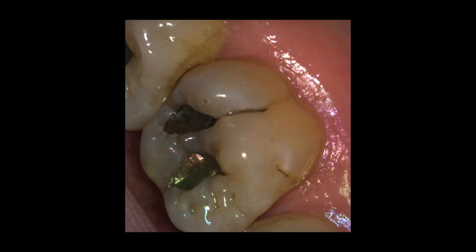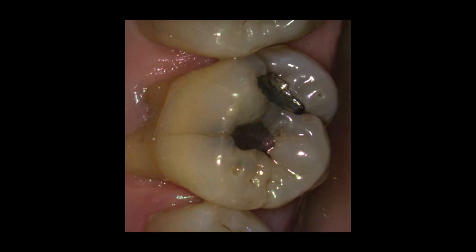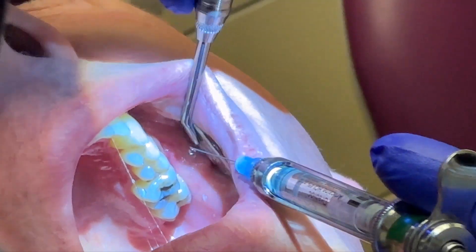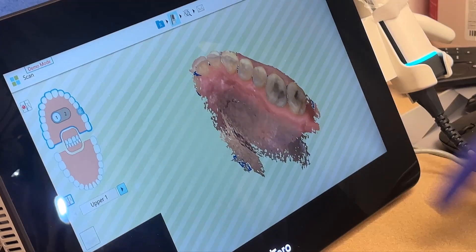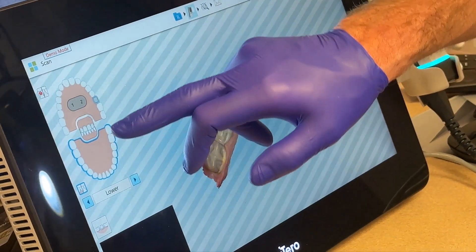We first have a few clinical photos showing you what everything looks like ahead of time. You can see on this picture we've got a fracture on the distal marginal ridge and also on the buccal aspect, so there were some concerns about this fracturing. It went from an inlay to an onlay to help protect that. You can also see a photo from the occlusal view. Here I am getting numb, and while I was getting numb, we took some pre-prep scans — upper, lower, and bite records — using the Itero Lumina.